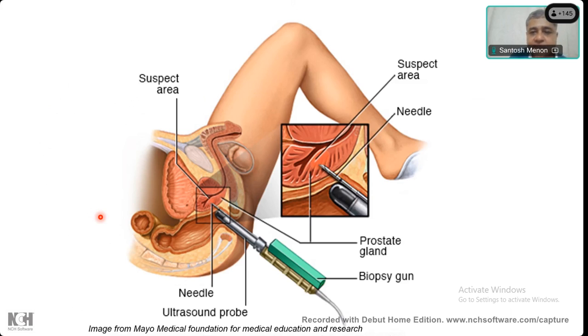So what is this image? Anybody? Ankita is there, or Smriti maybe. Smriti, can you tell what is this image? What does it show? It's showing the biopsy procedure of a TRUS guided biopsy.